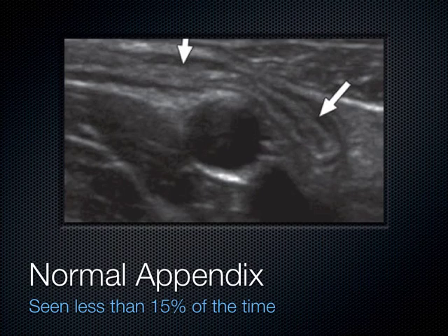It's a blind-ended tubular structure that hangs off the terminal ileum. And so you try to start around that area. You mow the lawn down in that right lower quadrant, transverse, sagittal, trying to find that structure that you see on the screen there. So burn that image in your mind. You may not see it for a while. I think, though, as you guys get really proficient with ultrasound over the next 4 years, if any clinician's got a shot at finding a normal appendix, it's going to be the people in this room.